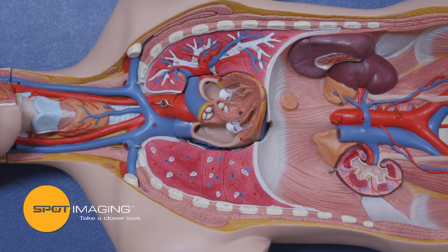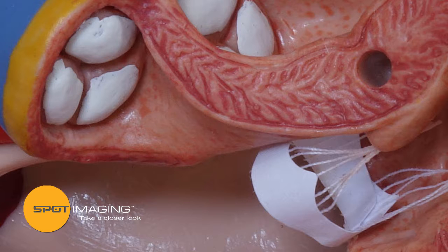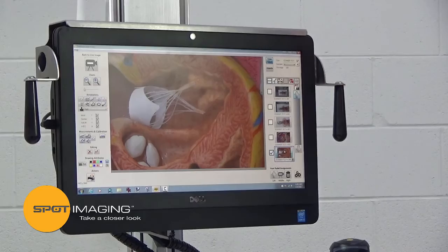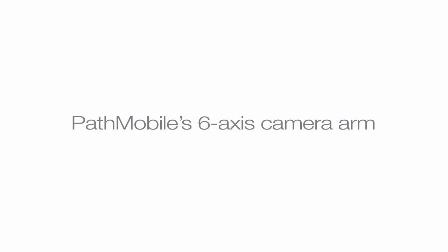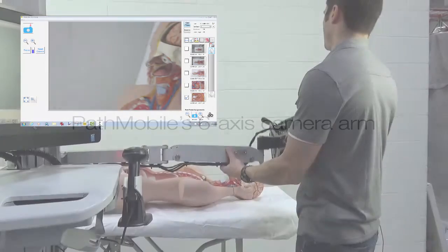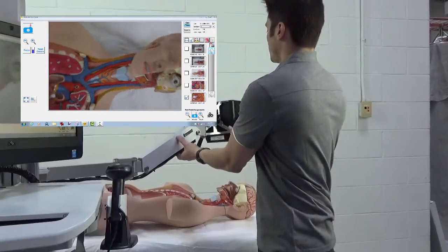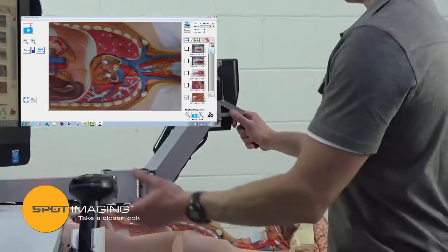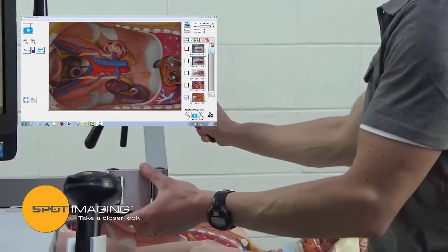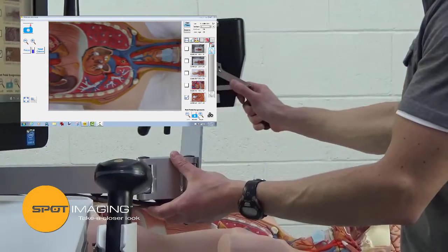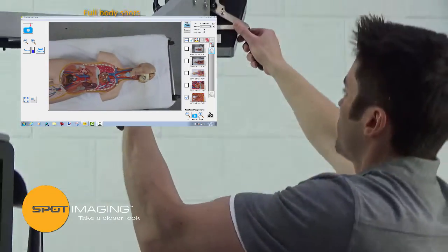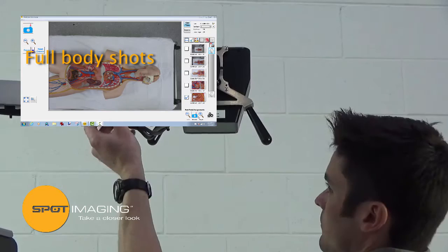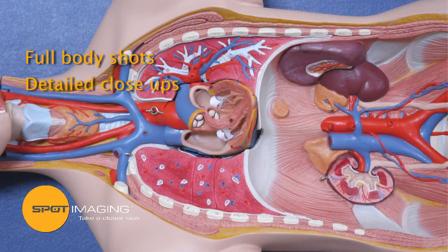The software can be managed with a stylus or gloved finger on our touchscreen computer, foot switch, or a dishwasher safe keyboard and mouse. PathMobile's six-axis camera arm and untethered six to eight hours of battery life make capturing previously difficult shots routine and easy. The stand effortlessly positions the camera over the body or alongside it to easily capture full body shots as well as detailed close-ups for your procedure.